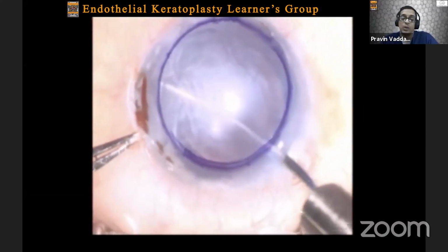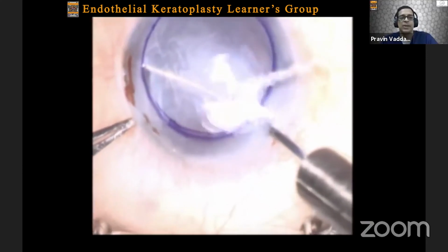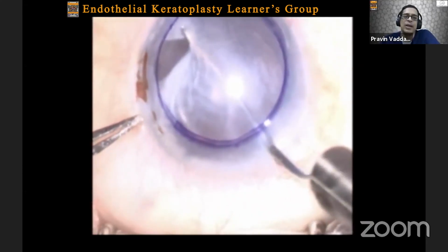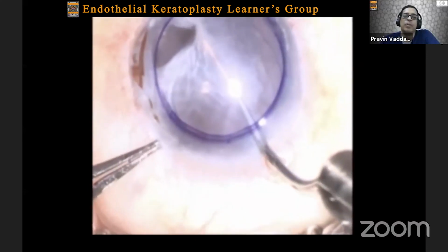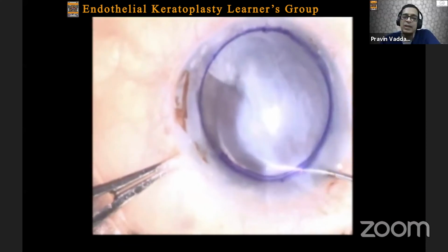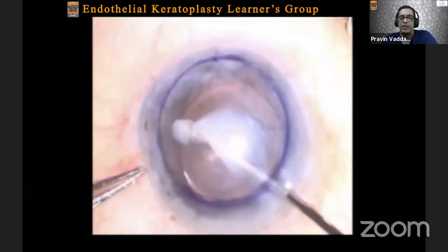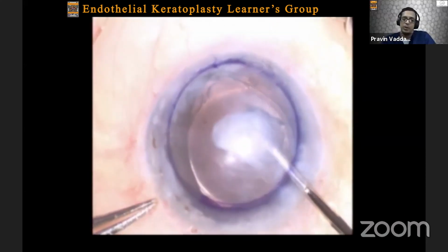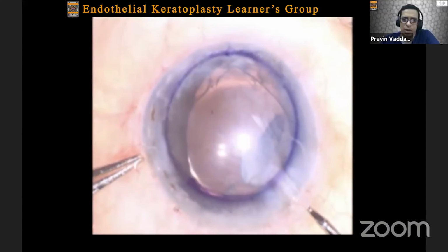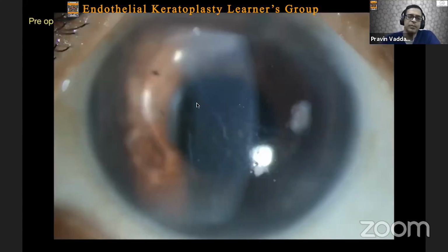Very rarely, and there is only one patient that I've seen, pseudophakic bullous keratopathy with such a thick retrocorneal membrane. You can see this is a patient who had significant amount of inflammation post-operatively. It formed a thick fibrous membrane, and in several areas, this is actually attached to the iris. So once you take this off, you can see the rest of the anterior chamber pretty well. But also remember that there's a Descemet membrane behind this. Once you take off this retrocorneal membrane, that you will need to take care of as well.